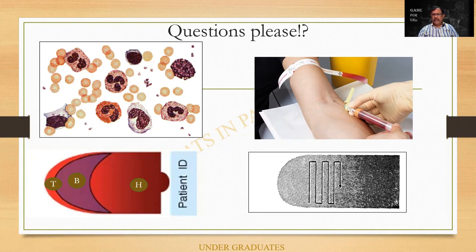And this is a cubital vein from which blood is usually being taken because it is quite spacious. It does not get dislodged very frequently, and you can have a cuff over here so that it is kept in between the systolic and the diastolic pressure. What are all the other sites from which you can take blood can be a question. The cells, of course, we are going to see repeatedly, and you should have seen it in physiology as well. This again we shall be visiting.